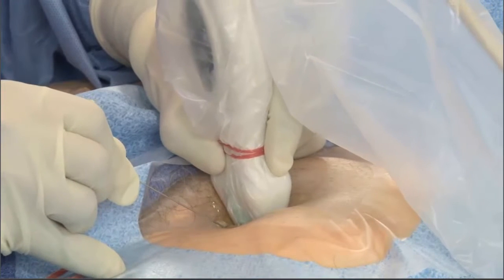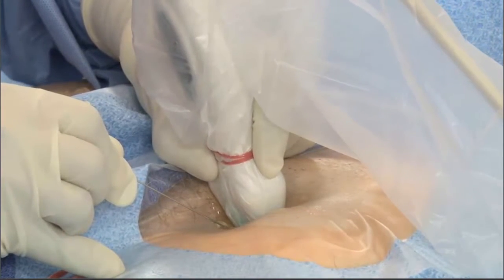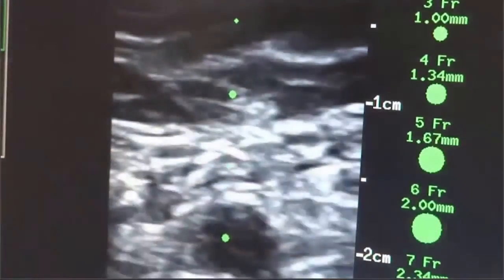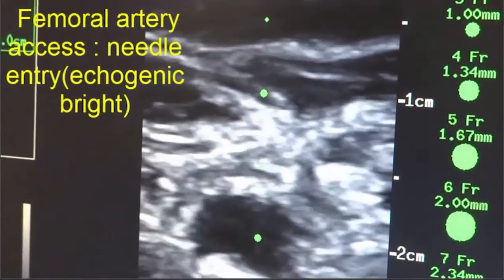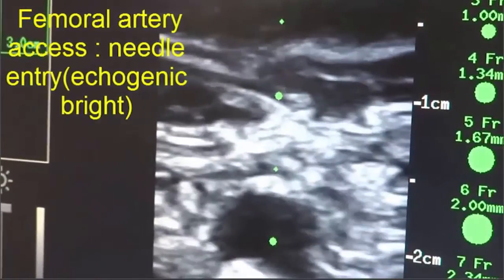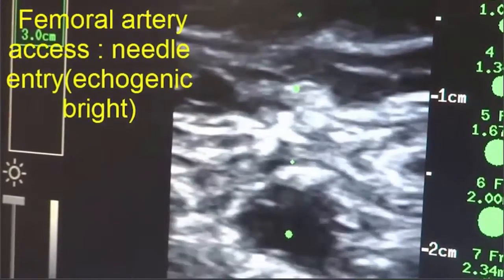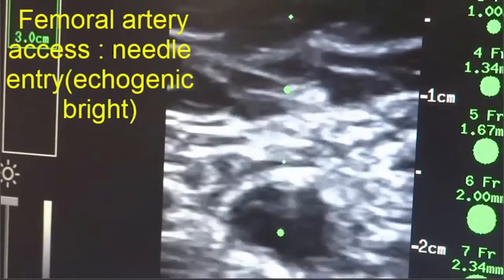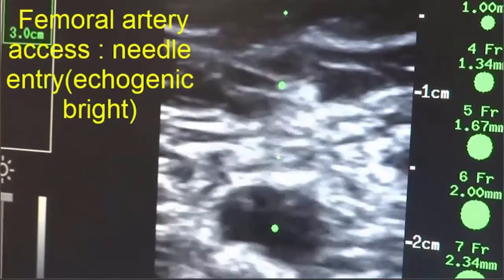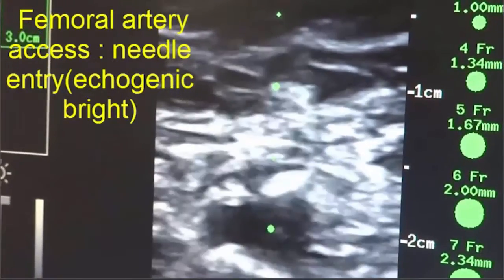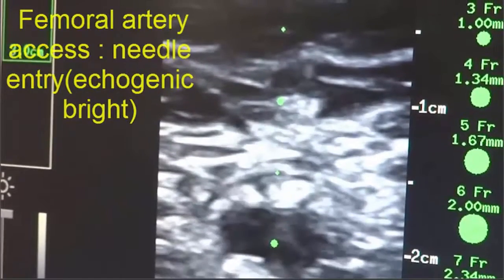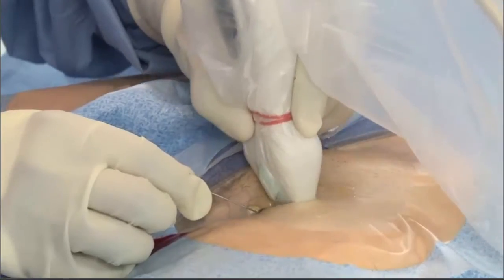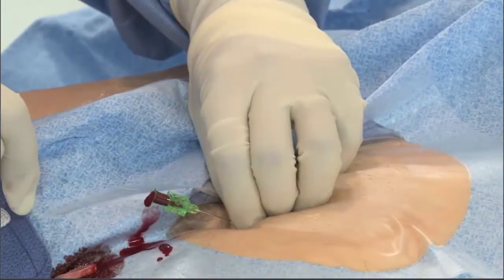During needle advancement, the anterior wall of the vessel is kept under the central target line. Once the artery is centralized using the green dotted line, you can see the indentation by the echogenic needle and needle entry of the anterior wall of the common femoral artery. Once the puncture occurs, the vessel wall returns to normal shape. Hold the needle, then remove the probe away from the needle and advance the wire.